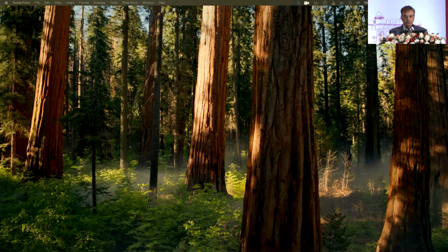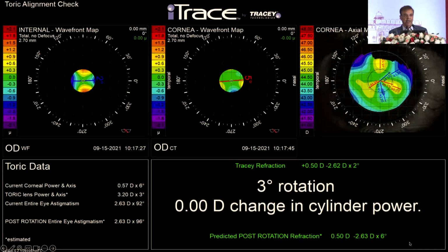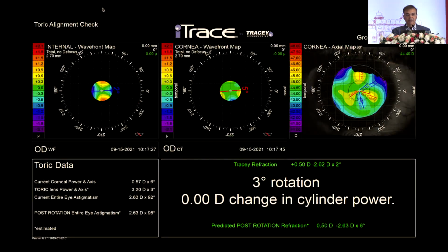Anyway, one way to do it, I usually do a single pass 4-throw pupilloplasty. It does a great job, and especially in these aberrated corneas, you can do an excellent job of also minimizing astigmatism. Today I might even try, this was done about 2-3 years back, I would have tried to do a single pass 4-throw and make it a pinhole pupilloplasty. Would have worked beautifully well as well.